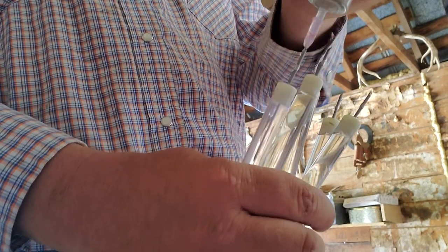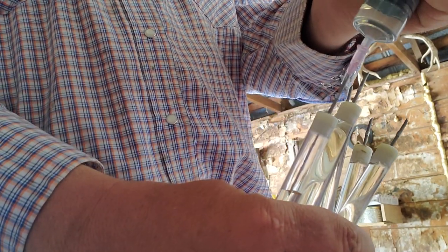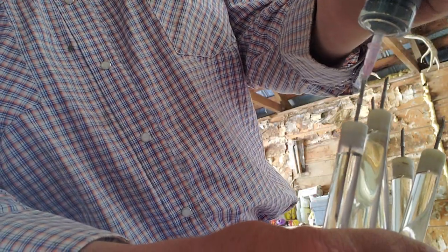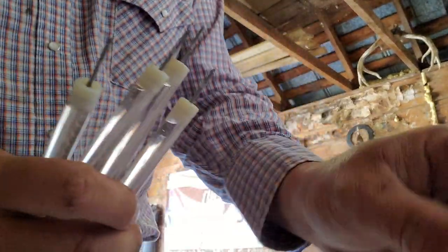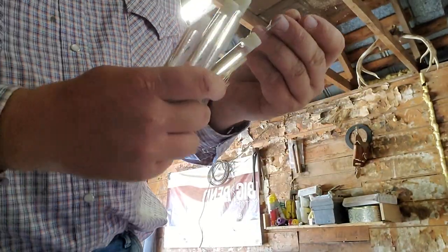I typically buy the 5cc darts because most of the cattle that we doctor are going to be in that 5cc range to begin with. That's typically what I do — I just get a handful of them and start filling. I buy them in bulk — about two or three hundred at a time — and just keep them on hand.